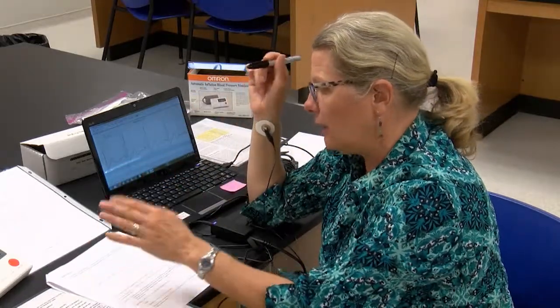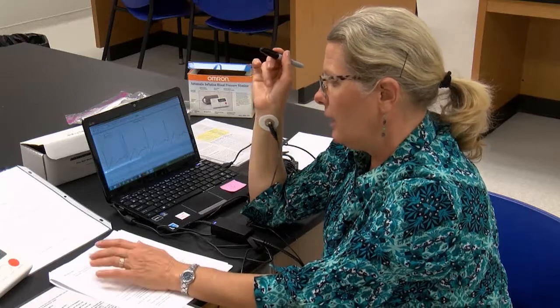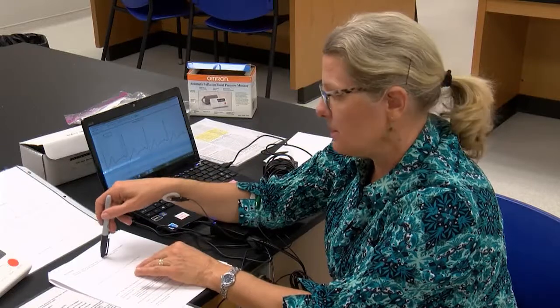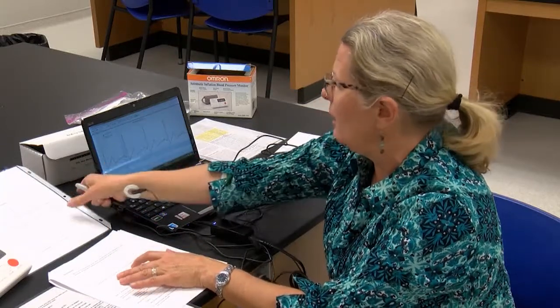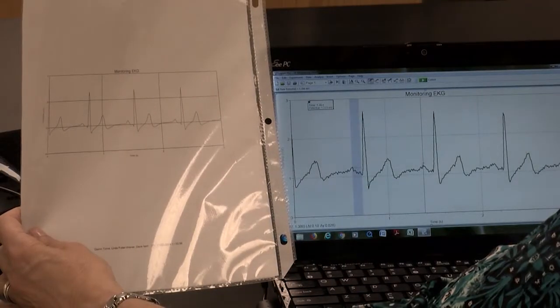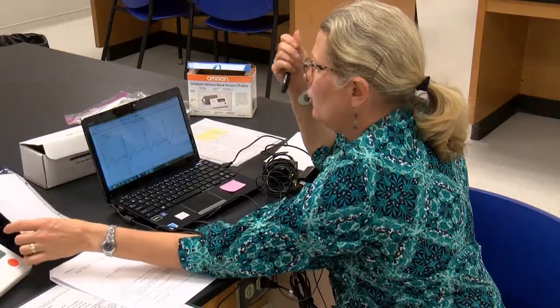Okay, so now we're going to look at the questions real quick. How do the blood pressure values manually from the computer program compare? Anyways, all I want you to do there is discuss a little bit about the blood pressure. Talk about the difference between when you're stressed out and you're not stressed out. Okay? How does your EKG trace differ from the typical? This one is the typical. This one is mine. Go ahead and you can make some comments. The most obvious difference is that noise.